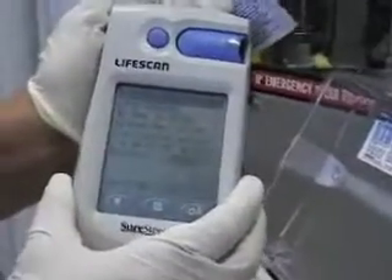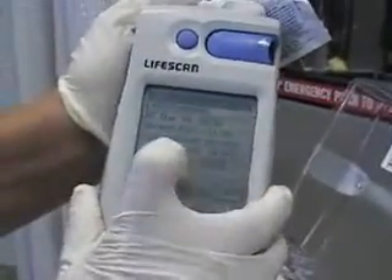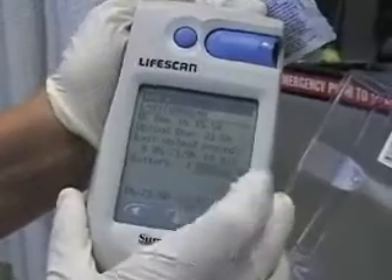There we are. LifeScan, we're going to do a blood sugar. That's the introductory screen — it tells you where your battery's at. It's almost full. Hit continue.